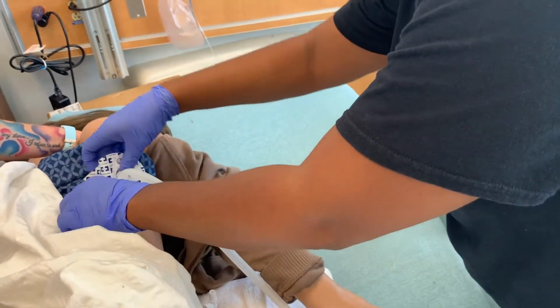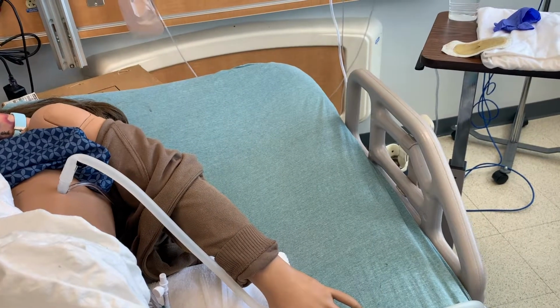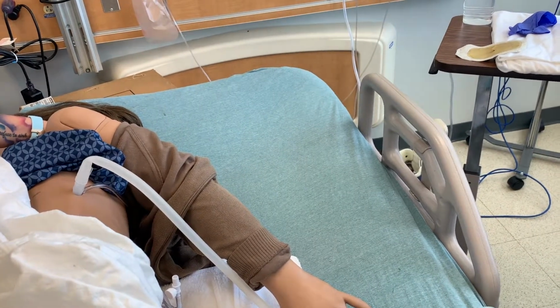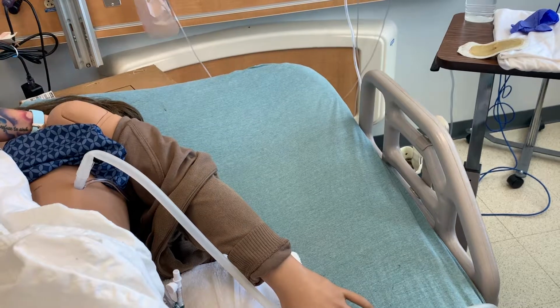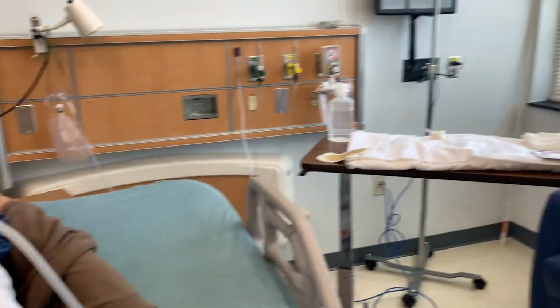Remove the dressing and note the color, consistency, and amount of drainage. Perform hand hygiene and don your sterile gloves.